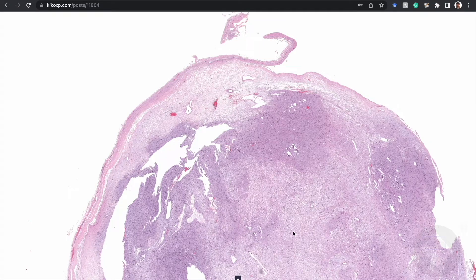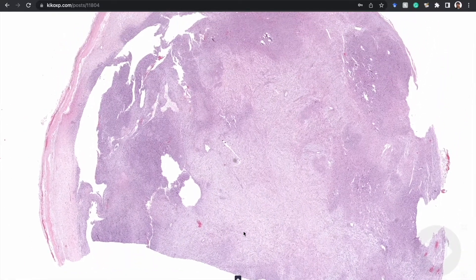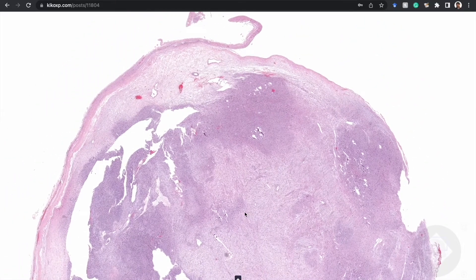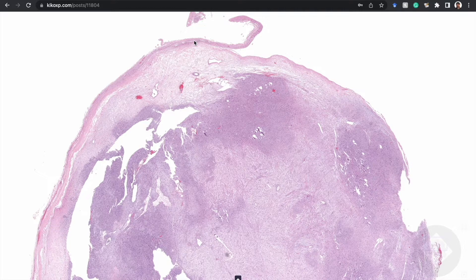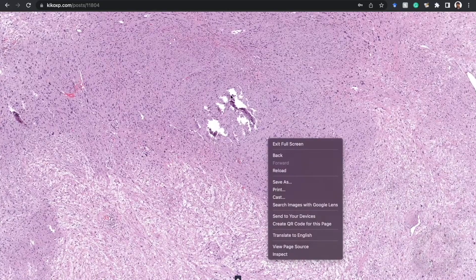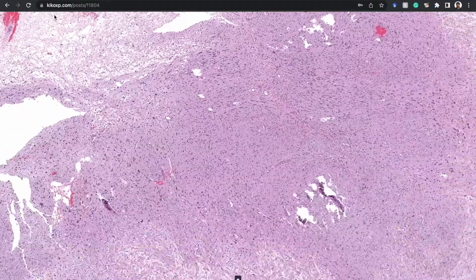This case involves half of a nodule — a popliteal mass in an adult woman, several centimeters in size. It arose in deep soft tissue. From low power, there's a thick capsule around the outside and very sharp circumscription; this lesion basically shelled out away from the adjacent tissue. With any experience, you'd recognize the diagnosis right away at low power: distinct hypercellular and hypocellular zones — this is a schwannoma.